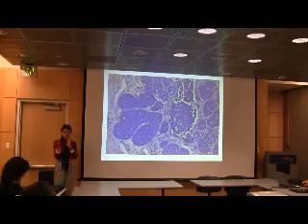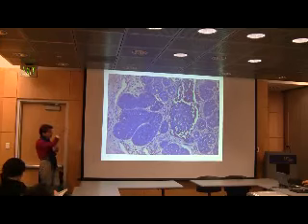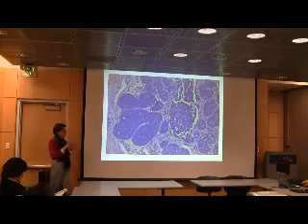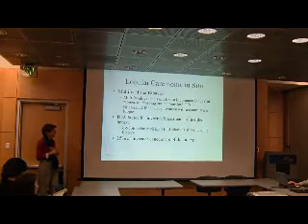And you can imagine that there is a gray zone there too. You look at it and you say, is it really expanded or is it not? And sometimes it's hard to tell. So we often look around, and lobular carcinoma in situ is usually not one spot. It's usually several lobules or many lobules that are involved in it. So we gauge from the whole process.